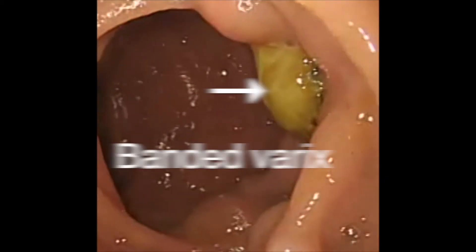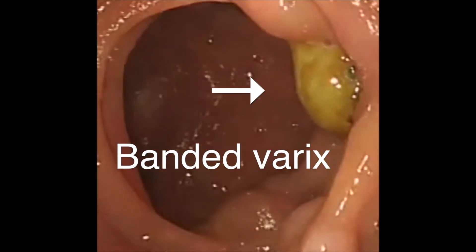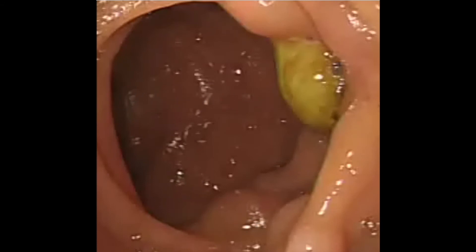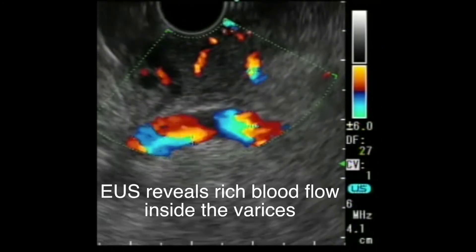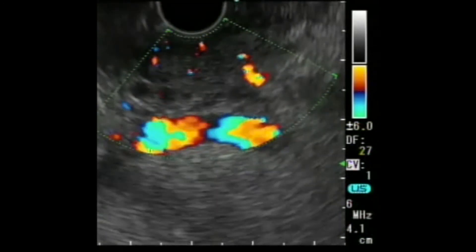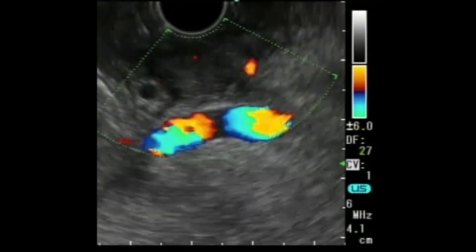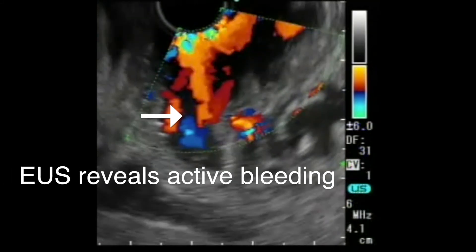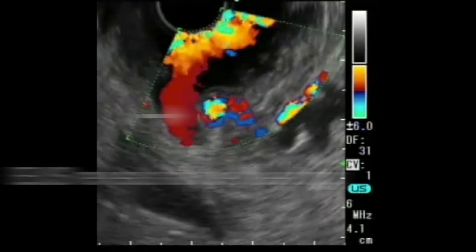This is the endoscopy image of the banded varix. Also shown in the picture, you can see multi-nodular varices. Using EUS, we were able to see rich blood flow inside the varices. During the procedure, the band came off and massive bleeding occurred. Even though the endoscopic view was poor, EUS made it possible for us to reveal the varix with active bleeding.